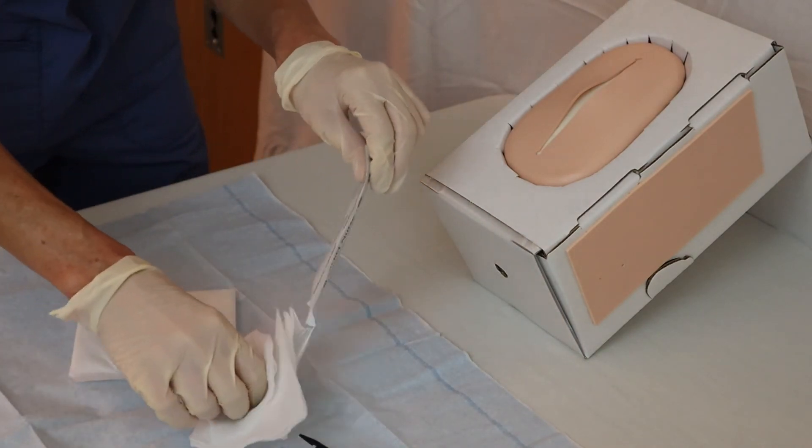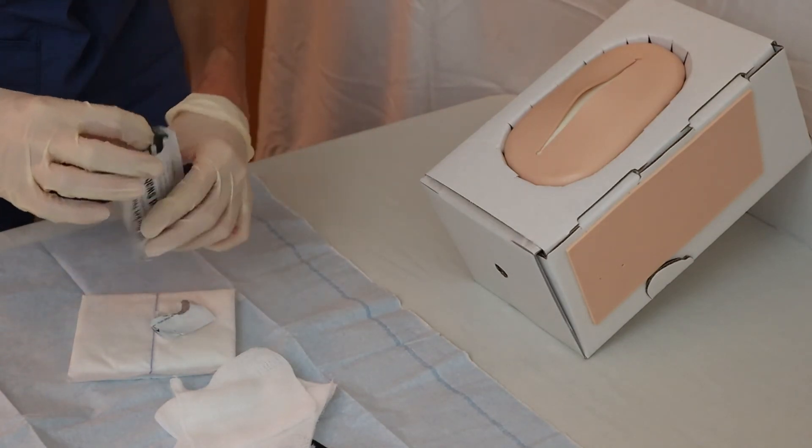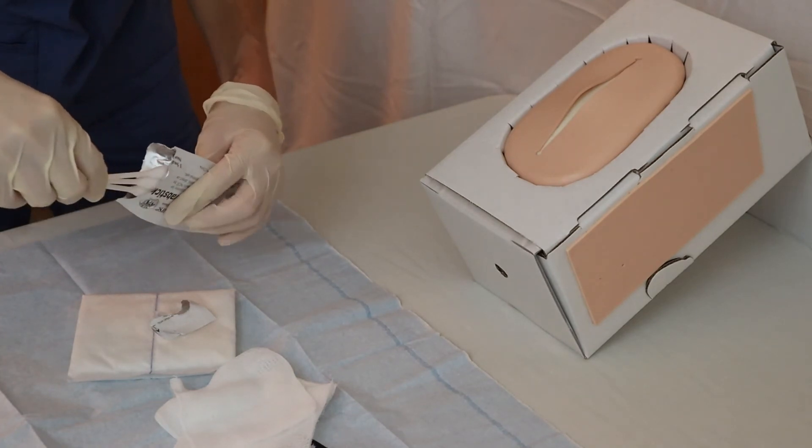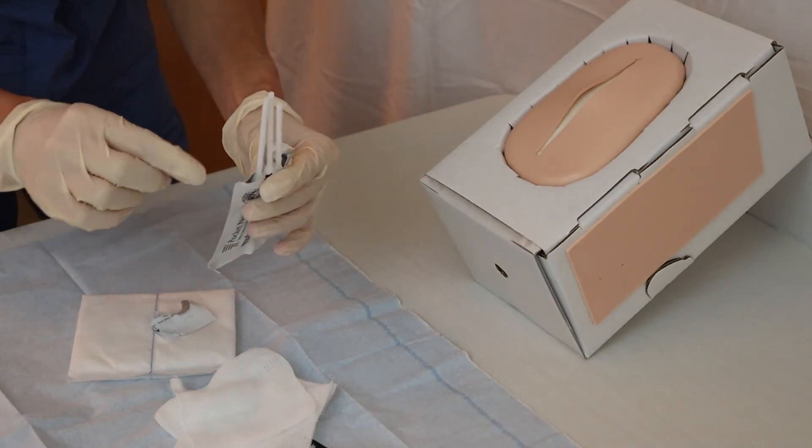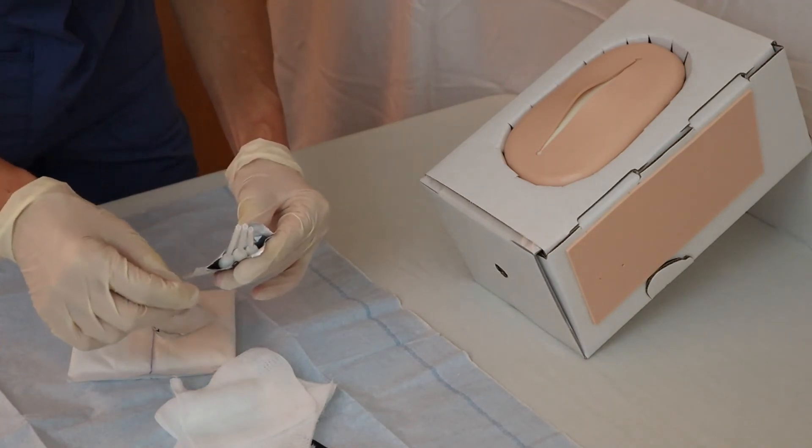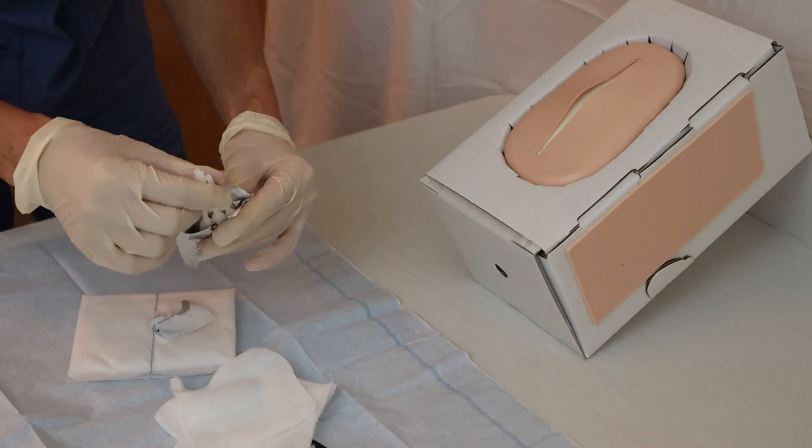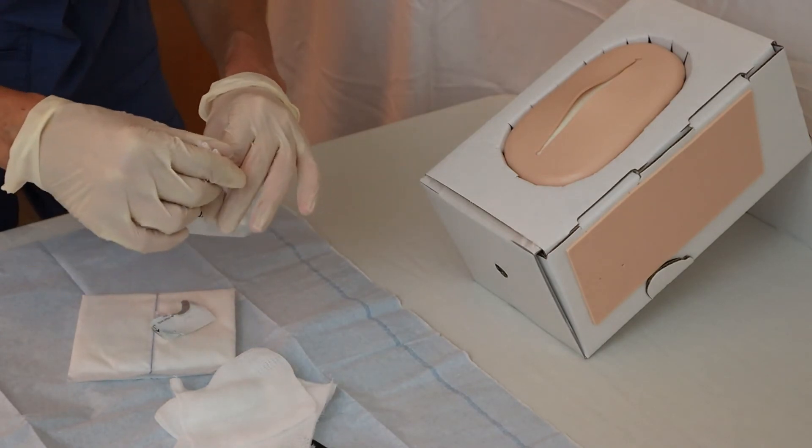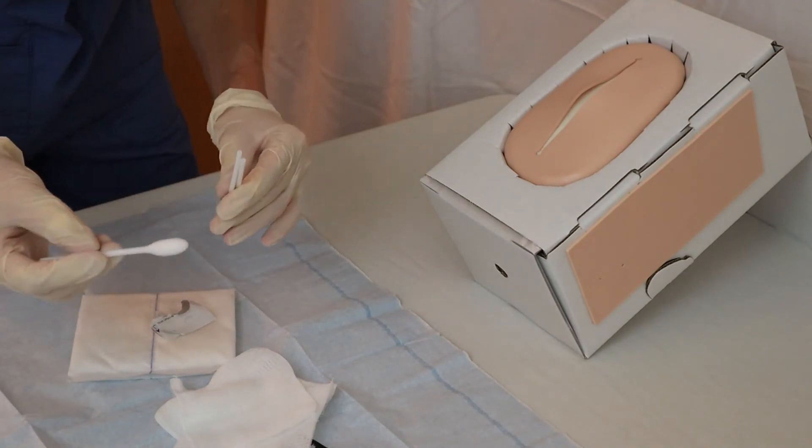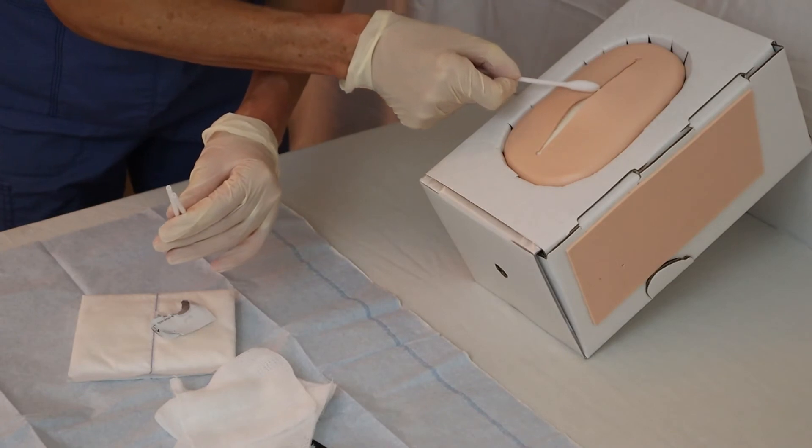I tear this off and it comes with these three swab sticks. Sometimes there can be some cleaning solution in there so you want to be careful not to place the wrapper on the sterile field where the fluid could leak out, because then you have a wet sterile field and now it's contaminated because germs could soak through there. So you want to either hold on to them, remove them and get rid of this wrapper, or keep it here but make sure that it doesn't go upside down.